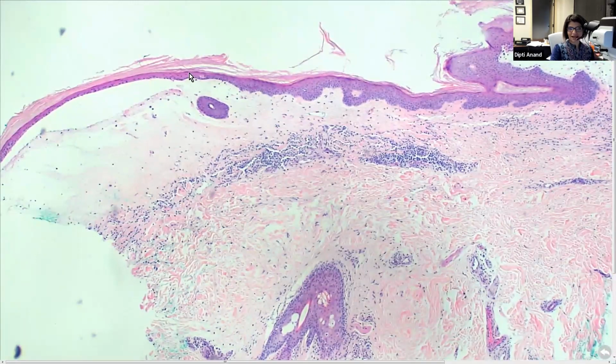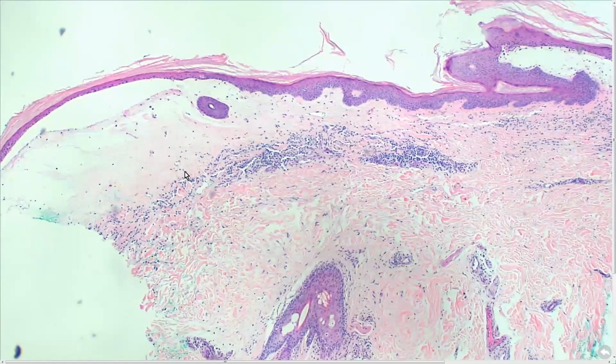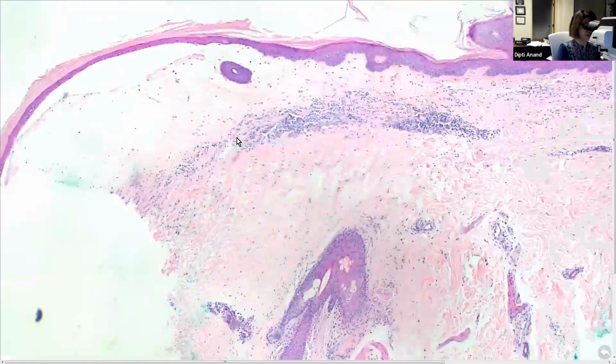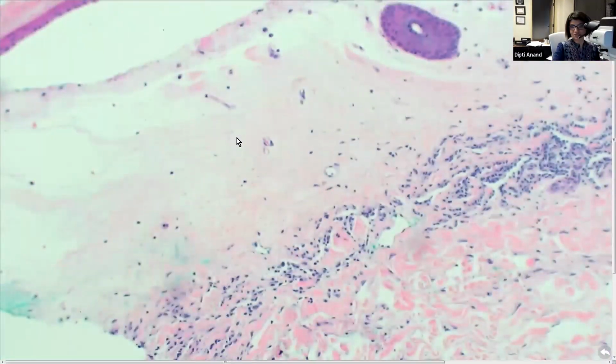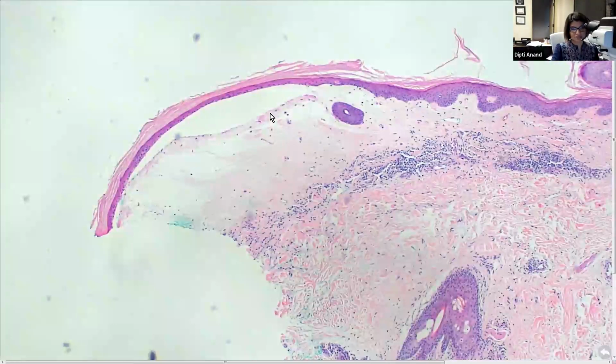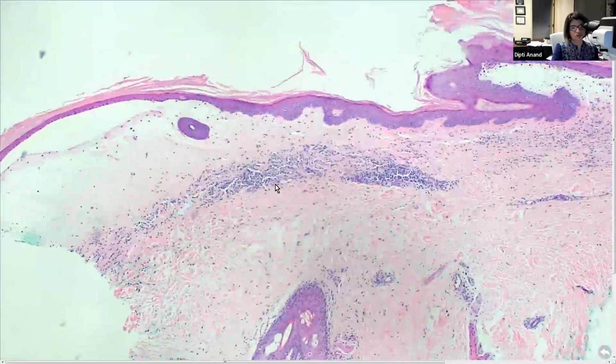You have epidermal atrophy, hyperkeratosis, and this lichenoid inflammation which has been pushed down. Sclerosis. Yep. And what does this look like? This is your homogenized papillary dermis. You can see this very loose papillary dermis. It's got a pink appearance and it's kind of broken down, so it can often even become bullous. It has this pale appearance. It's called a homogenized dermis.